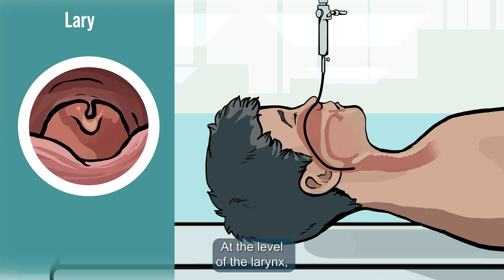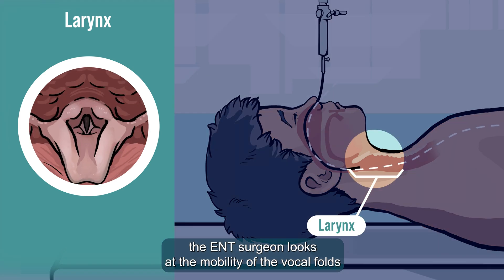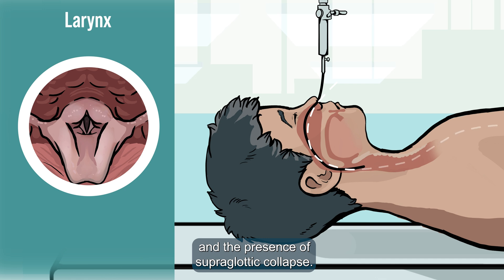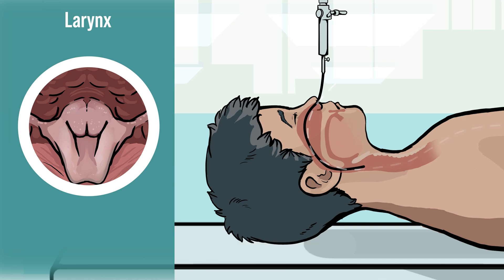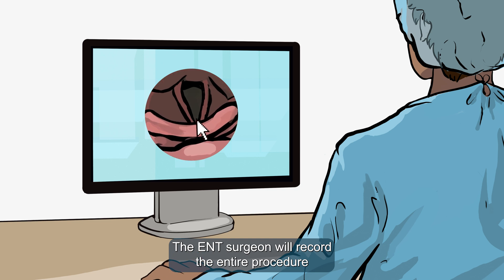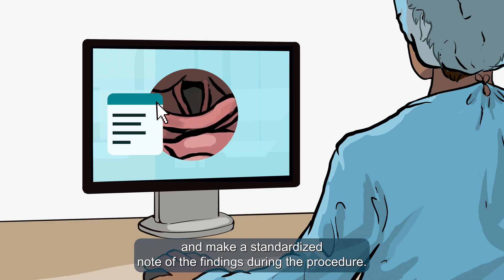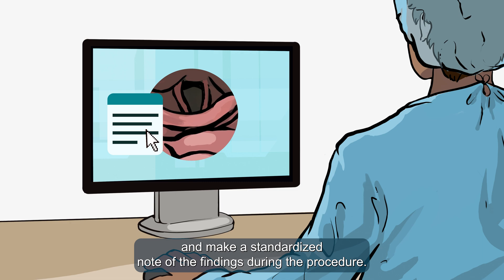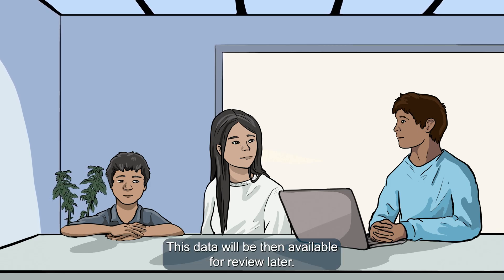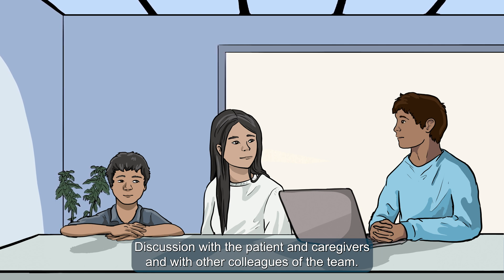At the level of the larynx, the ENT surgeon looks at the mobility of the vocal folds and the presence of supraglottic collapse. The ENT surgeon will record the entire procedure and make a standardised note of the findings. This data will then be available for review later, for discussion with the patient and caregivers and with other colleagues of the team.